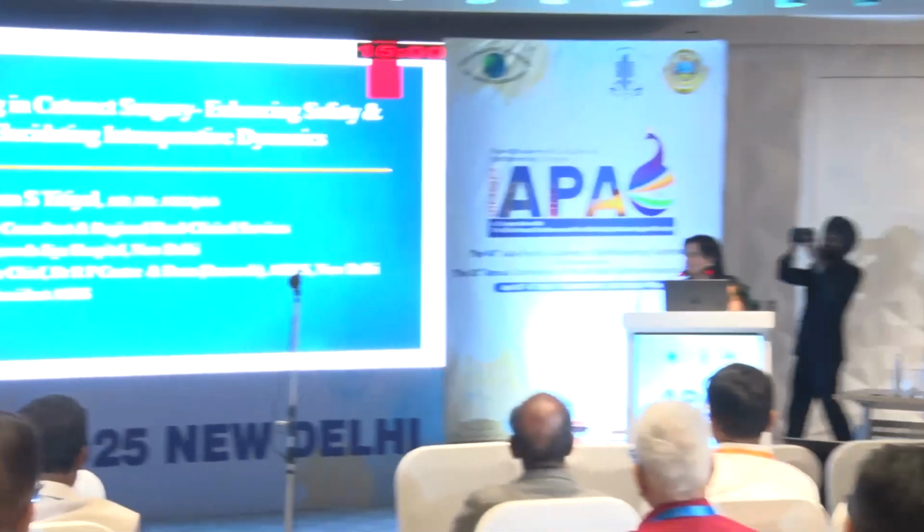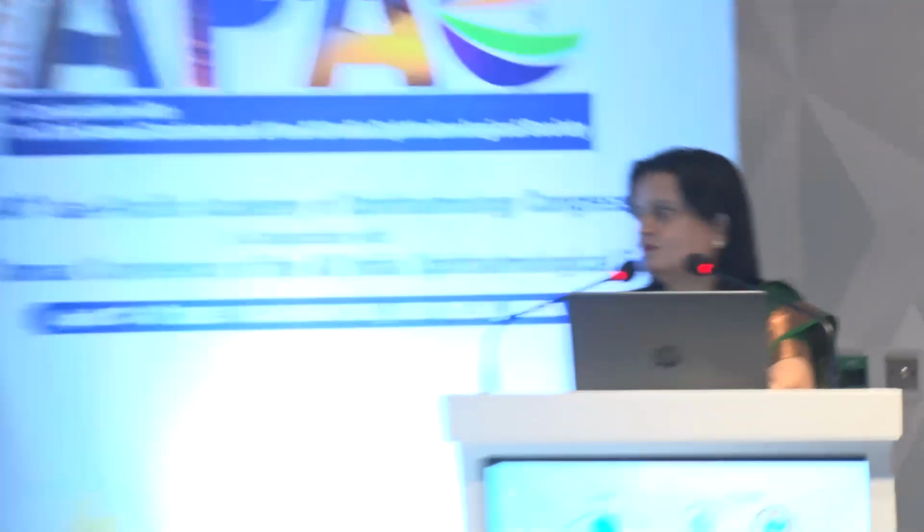I don't have experience with pinhole IOL, and corneal surgeons do pinhole pupilloplasty very little, because we like to address pathology of the cornea by treating the cornea. Pinhole will give you a vision, but I tend to think the field might be a little compromised. All these eyes are anyway compromised, so dilatation may be a problem, especially if they have some retinal pathology. Then it is very difficult, you have to undo the pinhole pupilloplasty and then do those procedures. These cases may require assessment of the posterior segment, and many times things can be very tough.